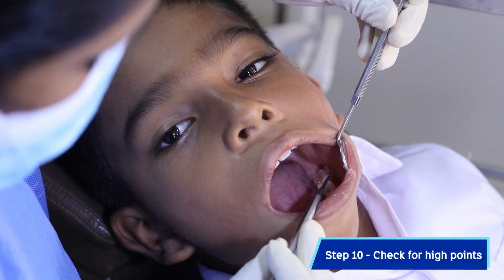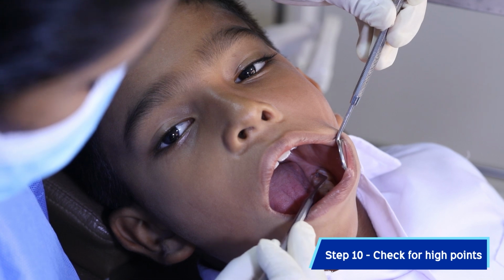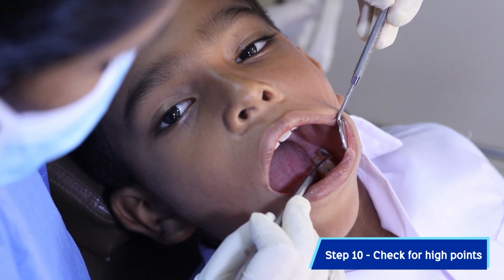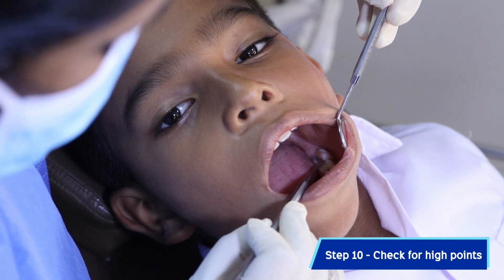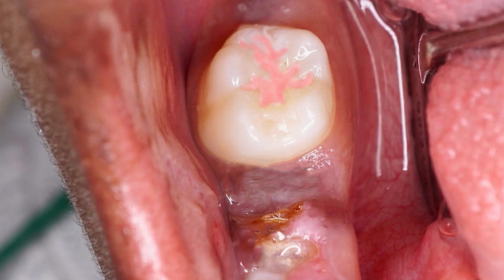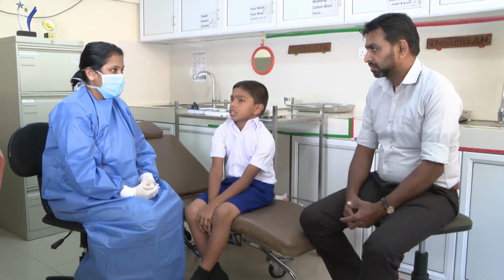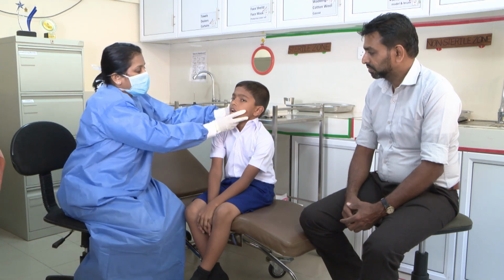Check for high points visually and tactilely and ask patients to bite and feel for high points. If occlusal high points are present, correct them. Instructions are to be given to the parents or the caregivers after fissure sealant application.